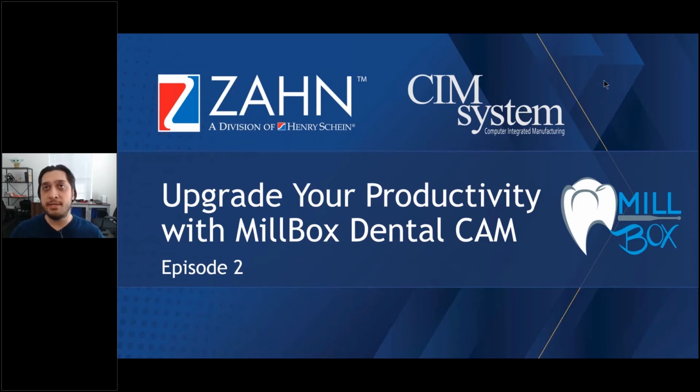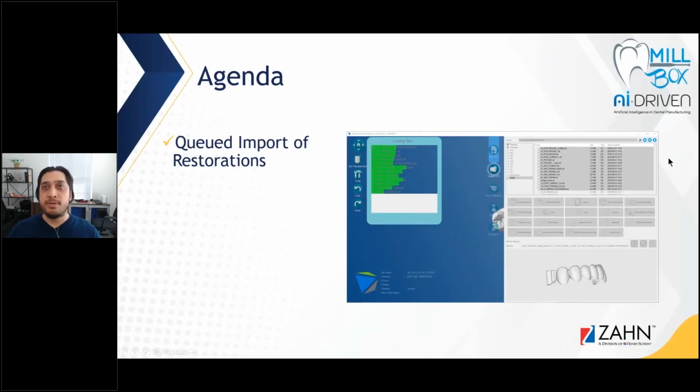But what we're doing in this series is covering 3 topics, basically outlining the productivity updates that you get as part of updating to the latest version of MillBox. And if you're not on MillBox, we're kind of showing you some of the tools that you're missing out on. So if you're either a Sun 3D user or you are using a different CAM software, this can give you a good idea of some of the key features that we'd like to highlight in the CAM. So let's go ahead and get started on that, and we'll talk about those 3 features that we're going to talk about today. So the first feature we're going to go over is the queued import of restorations.